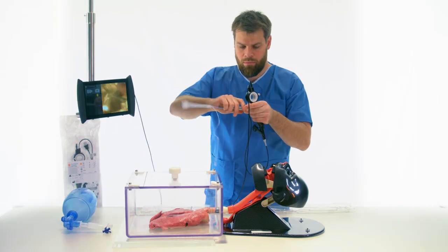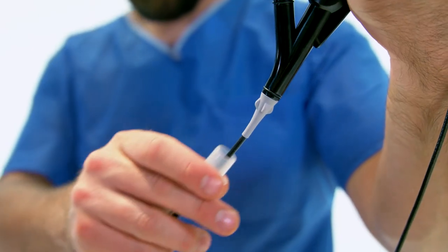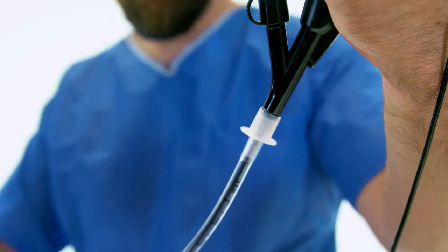An ET tube is mounted on the insertion shaft of the BroncoFlex. The piece between the handle and the shaft can function as a tube retainer.